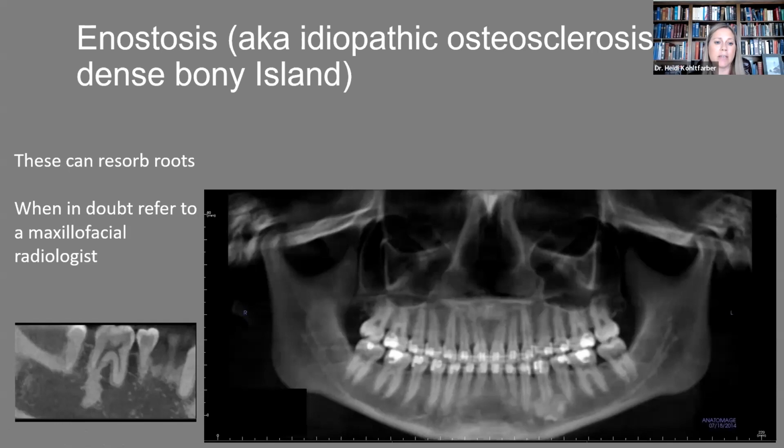So again, if you have any questions, always send them. You can send them out to maxillofacial radiologists. Like I said, we see these a lot, but they are do not touch lesions. We don't actually need to do anything about them.